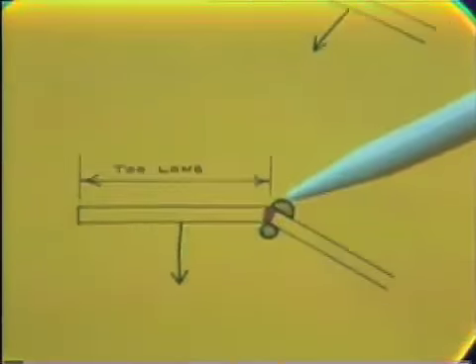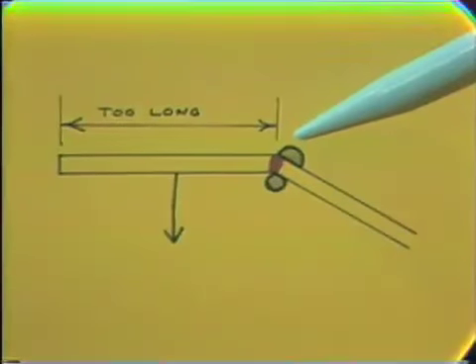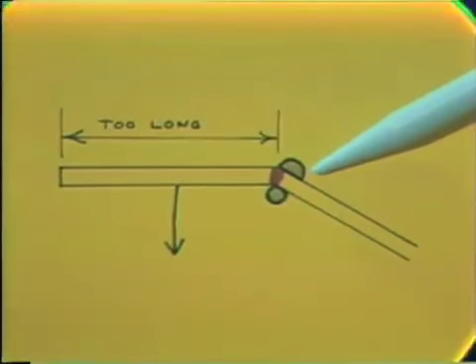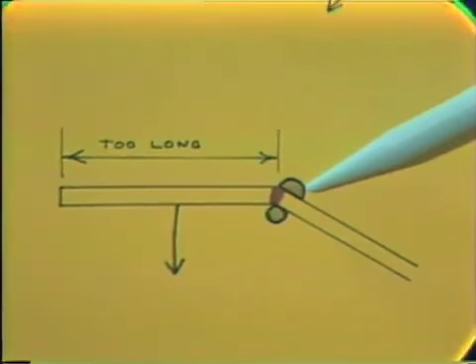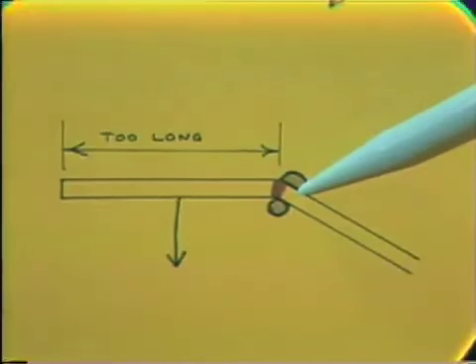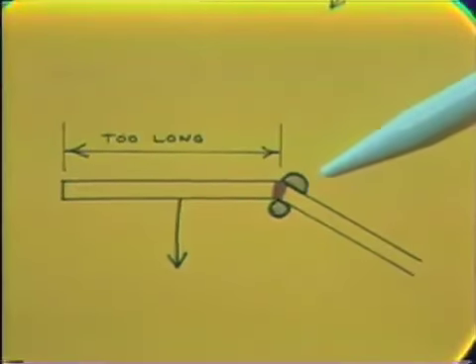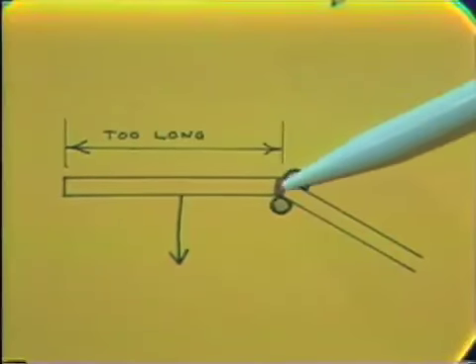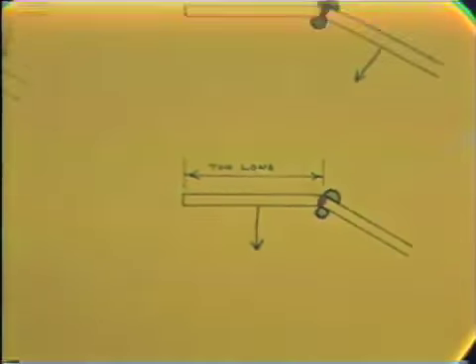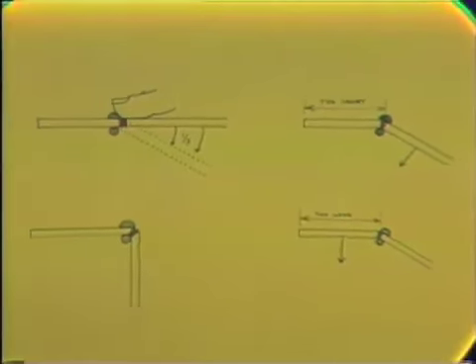If your bend was started too far down the wire, in other words, the first segment of the wire is too long, you grasp the wire beyond the pencil mark, and the first leg of the wire is bent back over the round beak of the plier. This will shorten this first leg in the wire and move the bend back. When the first bend is complete, the wire is marked, as before, directly at the corner of the pattern.